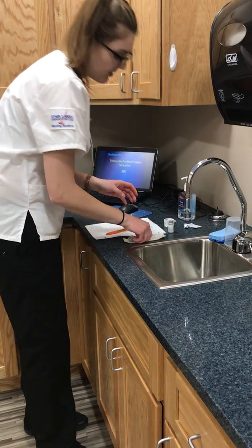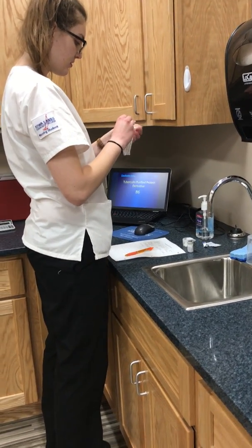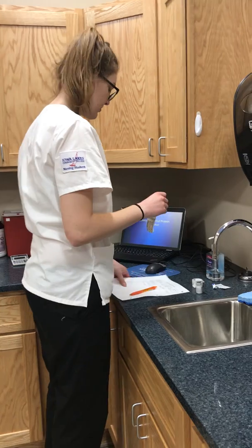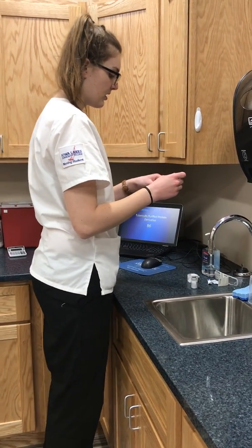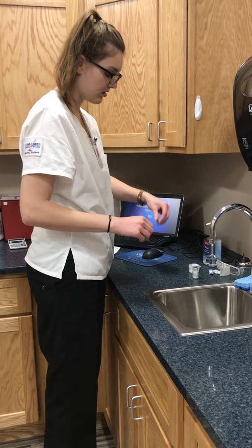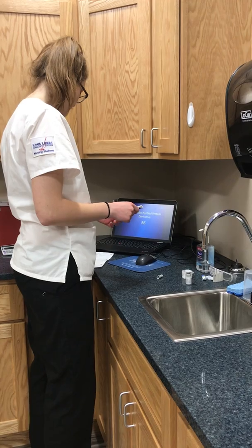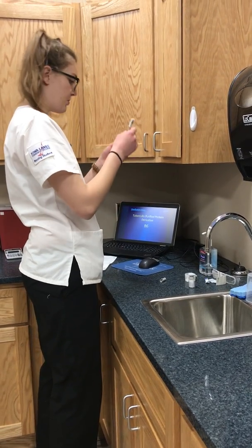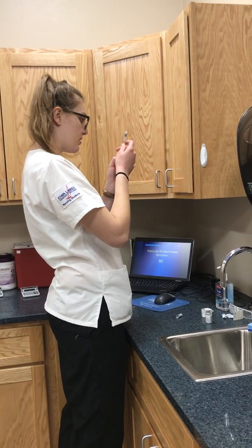I'll let that sit there while I prep the syringe. Set the cap here so I'm able to swoop and scoop later. And so I'm going to withdraw my 0.1 milliliters of air.